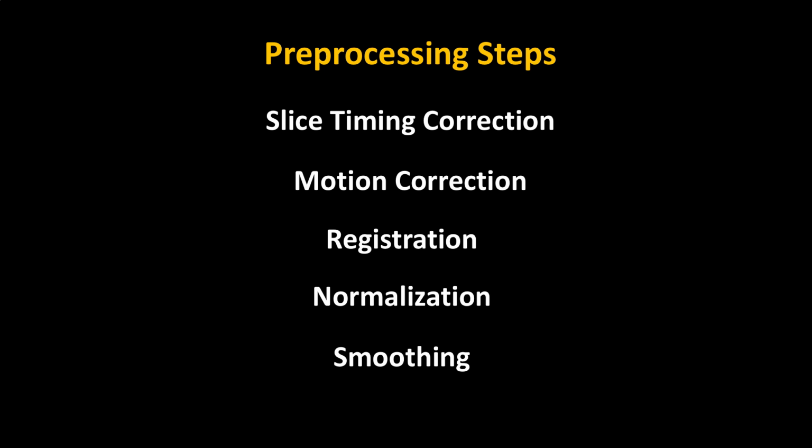Anybody do photography by chance? Okay. I don't either, but if somebody's moving around, that messes up the image. Lighting matters a lot. You do a lot of post-processing. You try to get the thing to look as good as possible. We're doing the exact same thing here.